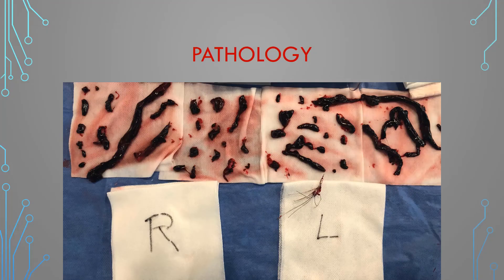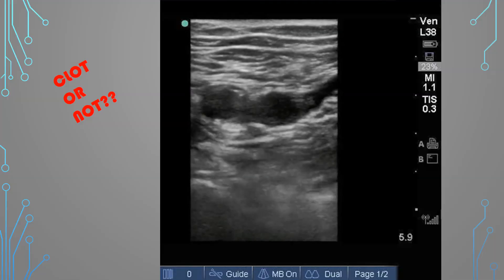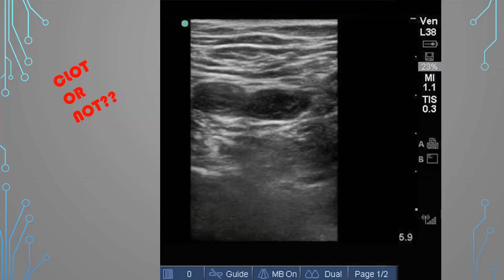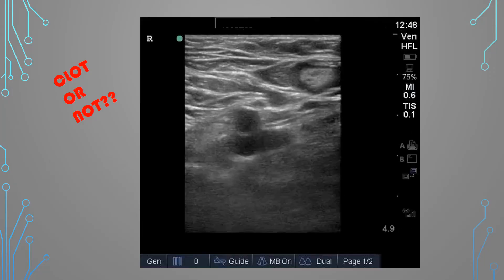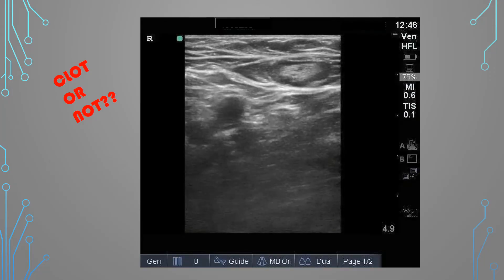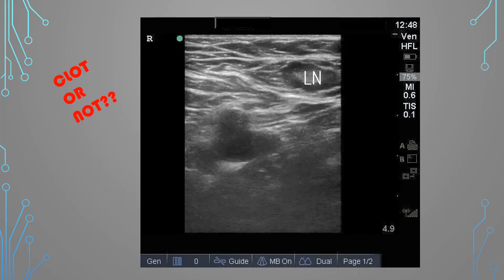Let's move on to some gross pathology. Here are clots taken out of a leg after a thrombectomy — pretty massive. Is there a clot or not? This is a proximal view with the greater saphenous in plane. Yes, there is a clot — when compression was attempted, the femoral vein didn't go completely away. The next case: don't be fooled by the sneaky lymph node at the top of the screen — this was not a clot. The vein was able to completely compress under pressure.